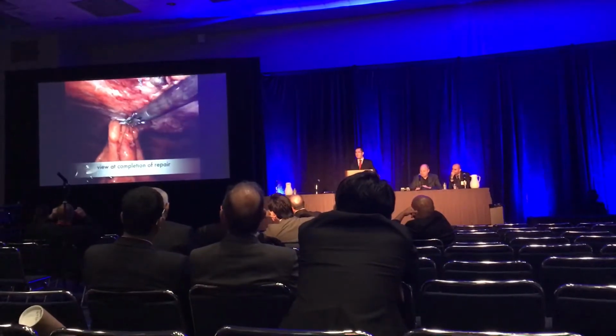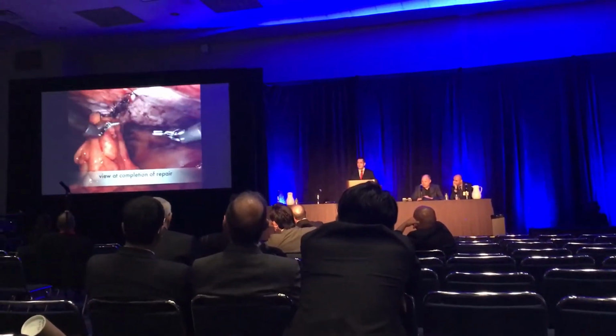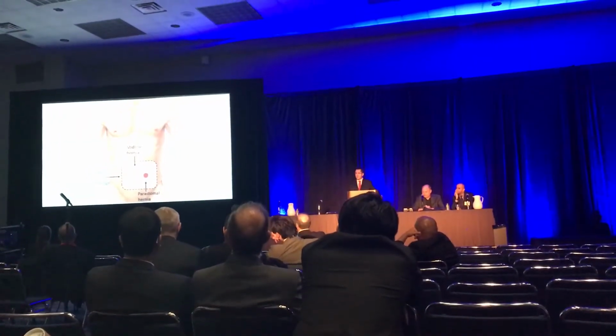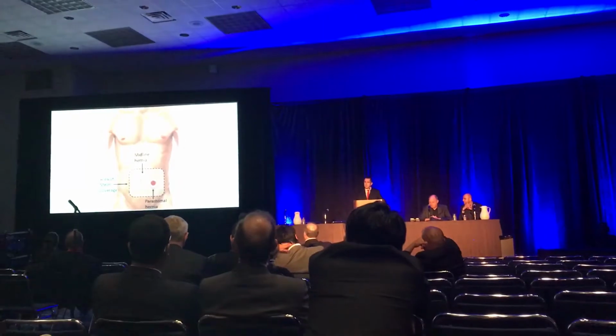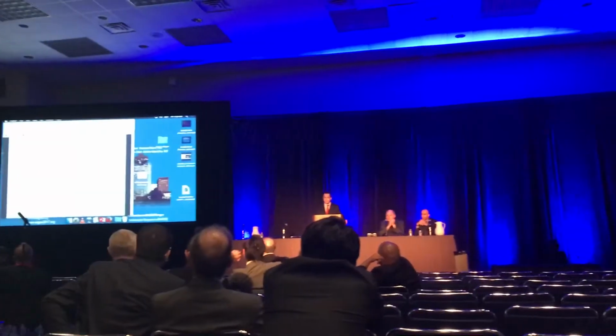And this is the final view of the repair after everything's been closed. This picture shows the mesh coverage that we're able to provide with this dissection. Thank you.